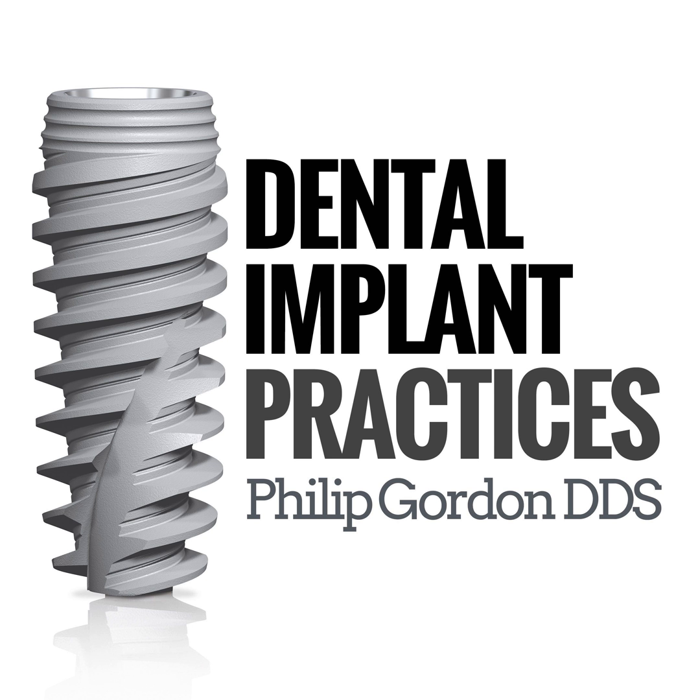All right. What I did is, from my special, Jeff, actually, we sit down and brainstorm at night, and he also had some input into it. So he said that you've been a proponent of the machine collar, so we need to go back to that. And so we kept the 1 millimeter machine collar. And then I said, well, I want to make the threads more aggressive. That's one of the downfalls of Replace, that we do a lot of immediate extraction.